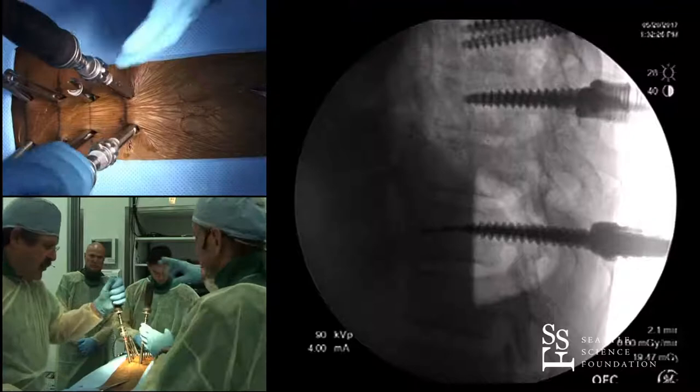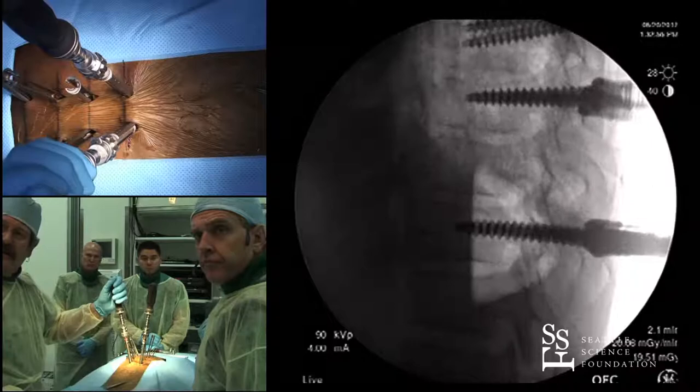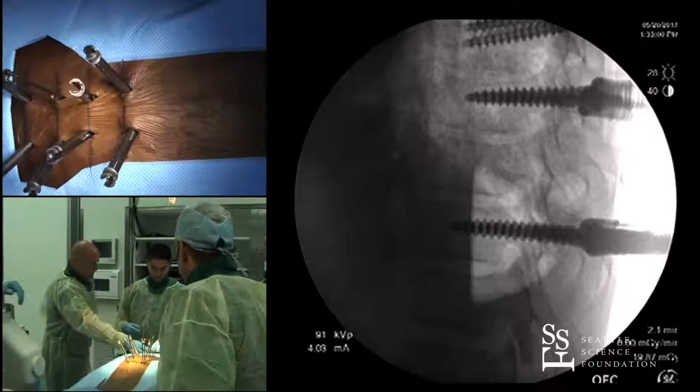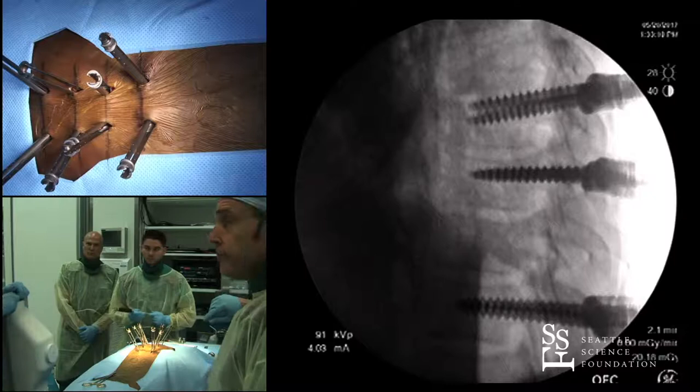I want to get the depth of our screw to match the screw above, so that when I pass my rod I'm not trying to change the depth of one vertebral body relative to the one below. If you jam them too deep you'll block the tulip head from going, so you don't want them bound too deep. So we've got a screw, we skip the body — we've got two screws. We're going to assume the fracture is between those two.